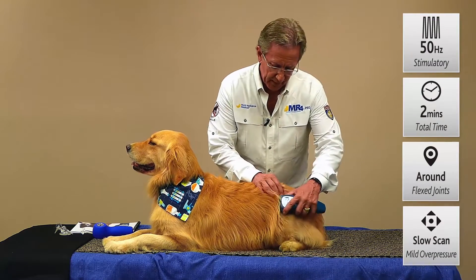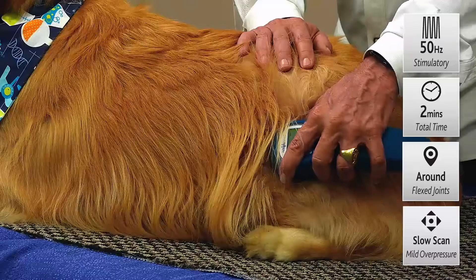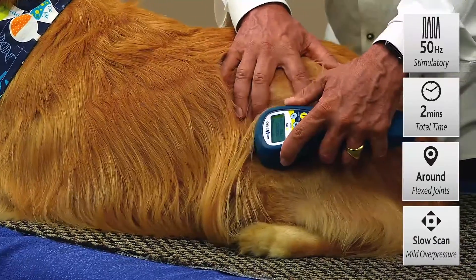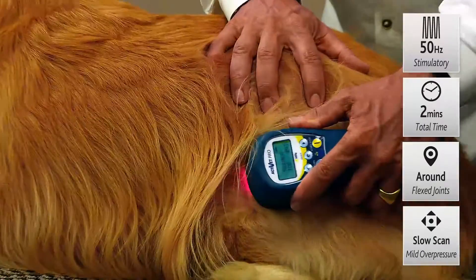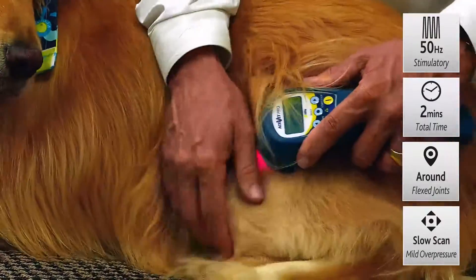So we'll work over these hips and just give it some light compression. One of the beautiful things about our super pulse laser is there is no thermal overloading of the tissues, so you're quite free to press against those tissues, move blood and fat out of the way, and get it right into those joints.